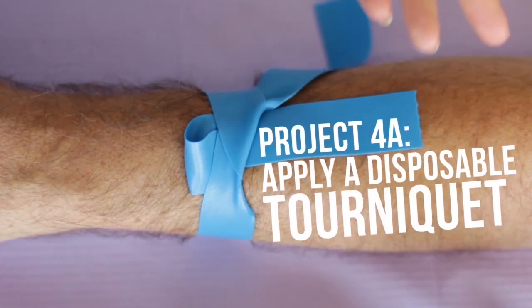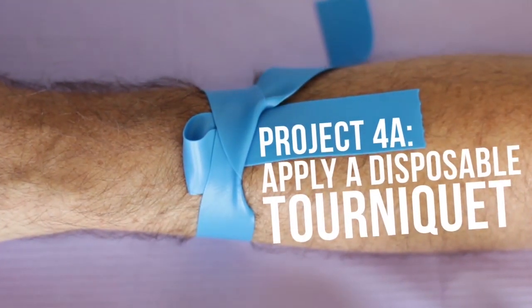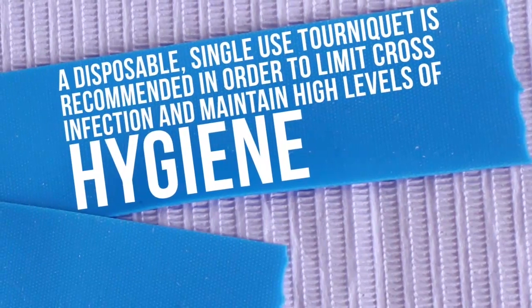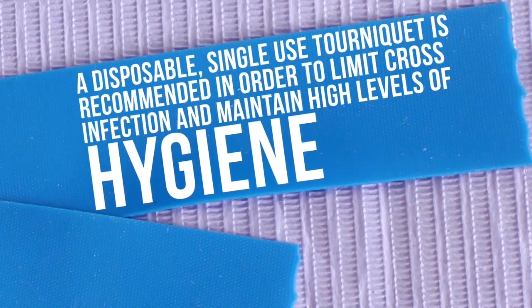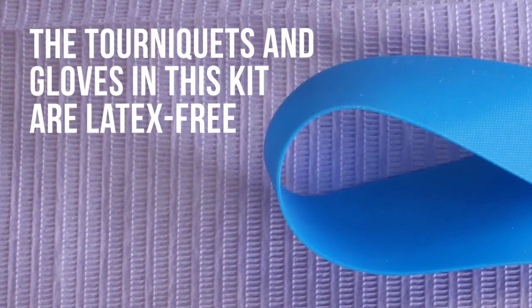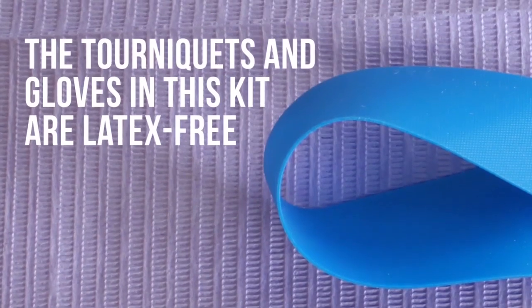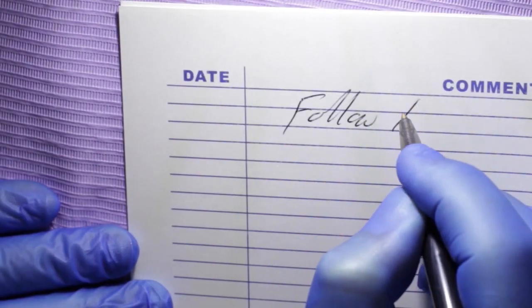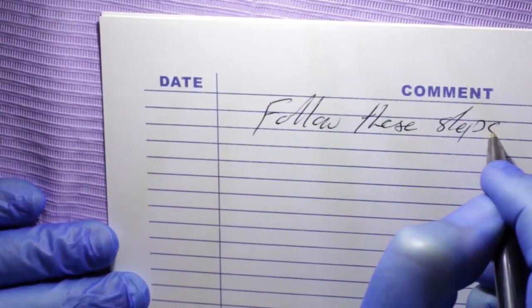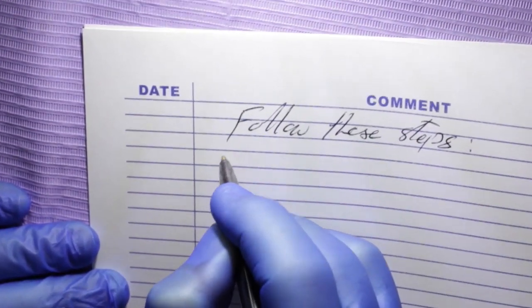Project 4A: How to Apply a Disposable Tourniquet. A disposable single-use tourniquet is recommended in order to limit cross-infection and maintain high levels of hygiene. The tourniquets and gloves in this kit are latex-free. Follow these steps to place a stretchable ribbon single-use tourniquet for performing phlebotomy in the cubital fossa area.